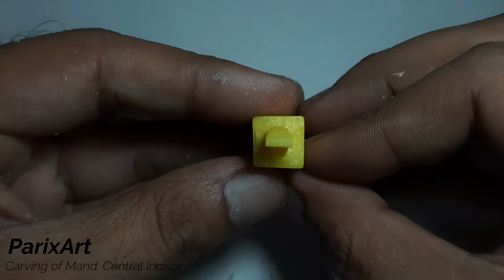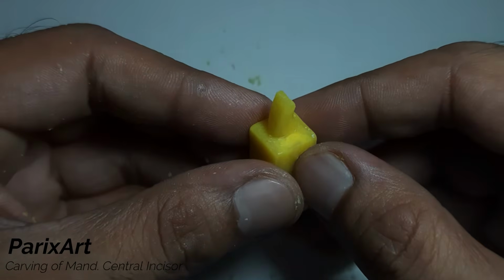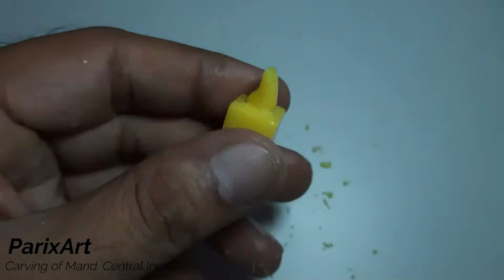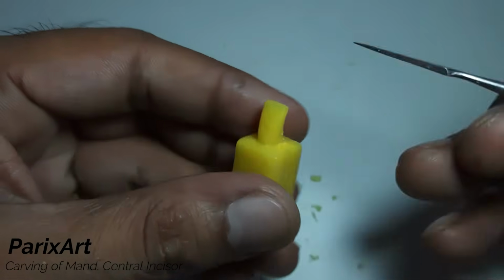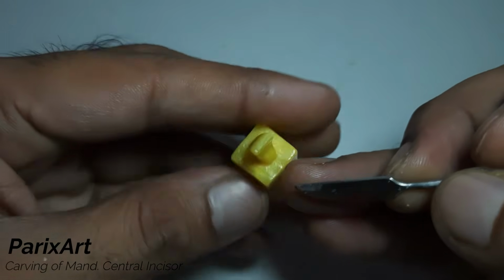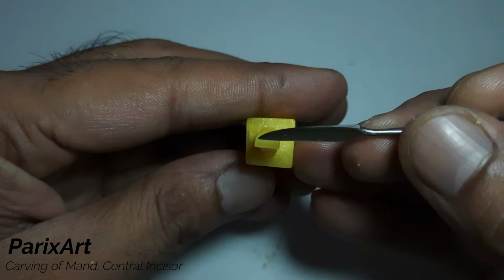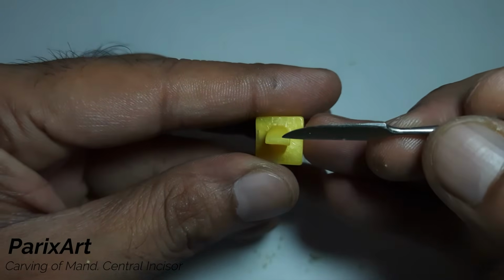See the contours now. As we view from the incisal, we know that the incisal third is flatter.